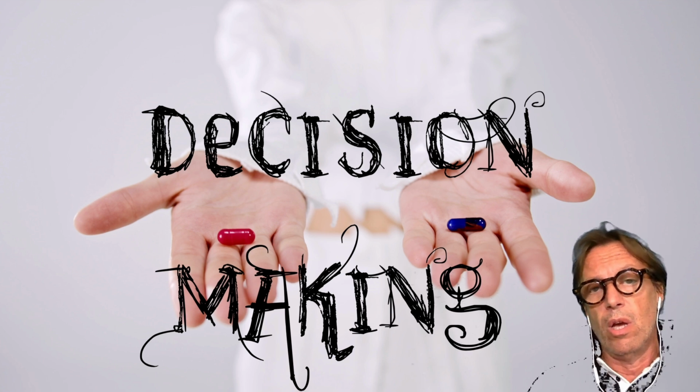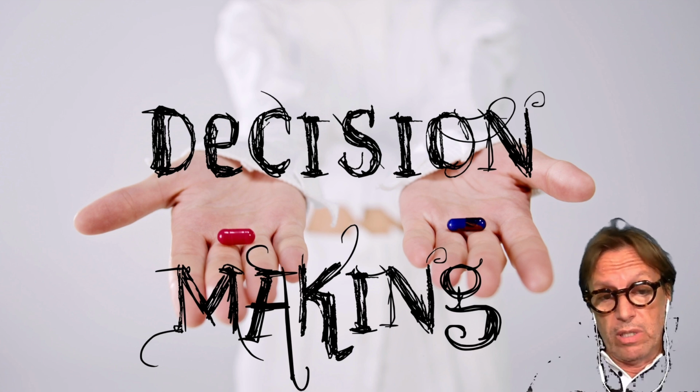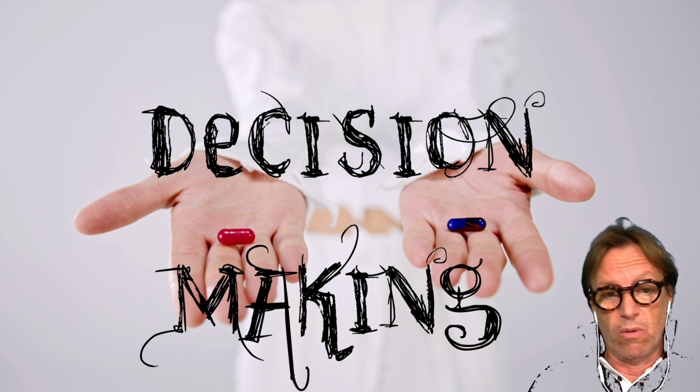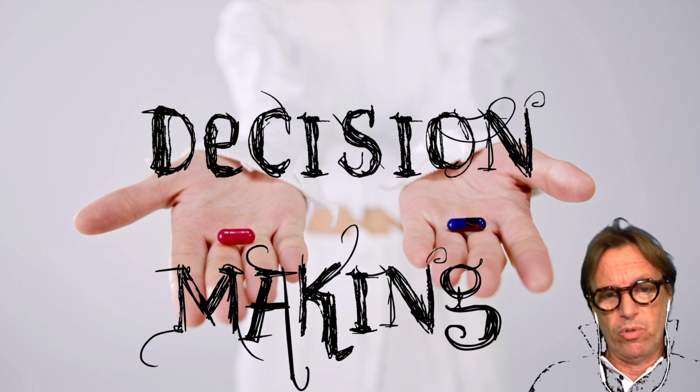This doesn't mean that we have to perform surgery all the time. It depends, for example, on whether we have to do some disassembling, removing crowns, bridges, or posts. So that's why sometimes endodontic surgery is the minimally invasive approach that we can choose.